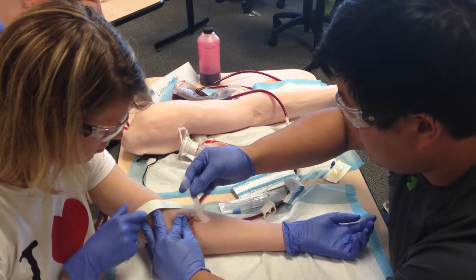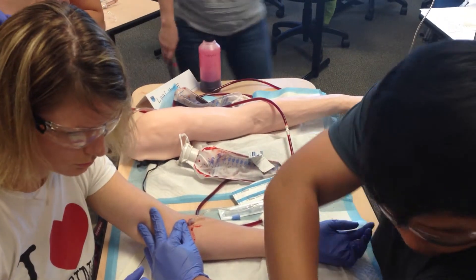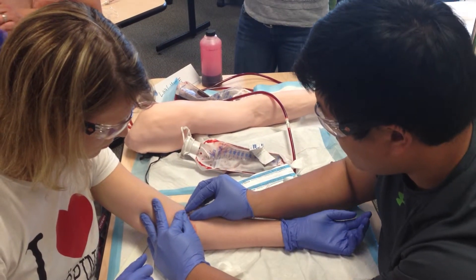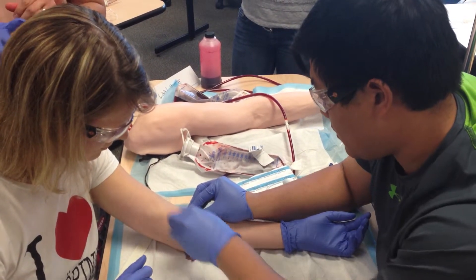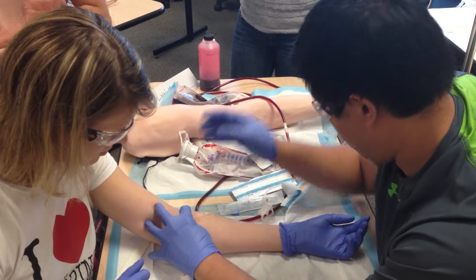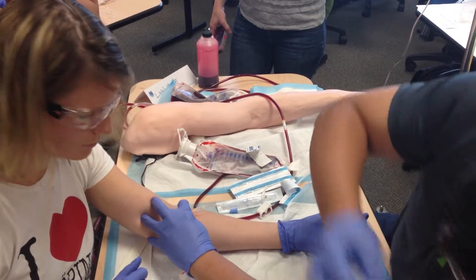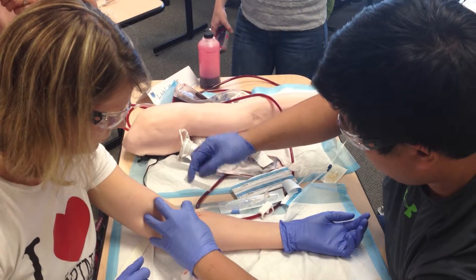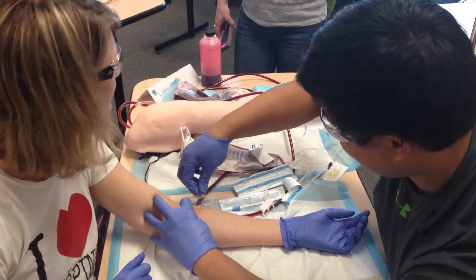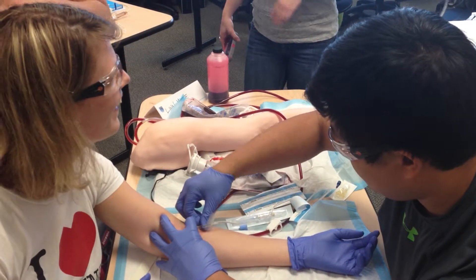What I would do is take some 2x2's and dry that off first. And we got drip — lots of drip. Are you dehydrated? Did you drink too much last night? We'll give you a little fluids. I went swimming this morning. Oh, might be a good thing today — so you're full of water.